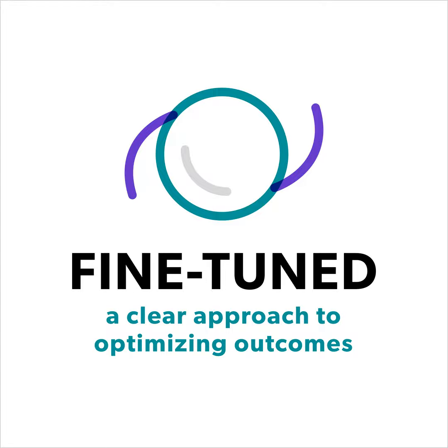What do you find is the advantage of wavefront-guided versus wavefront-optimized and topography-guided? There are a number of advantages of wavefront-guided over wavefront-optimized and topography-guided LASIK. As noted in our recently published study, wavefront-guided has better outcomes in a number of categories compared to wavefront-optimized. One big advantage of wavefront-guided over both wavefront-optimized and topography-guided ablations is that the refractive error is objectively measured by the aberrometer and is not based on subjective manifest refraction. We use the subjective refraction to verify the wavefront-guided aberrometry generated sphere and cylinder, but base our treatments on the objective measurements. This allows for very precise measurements of refractive error. For me, the major advantage of wavefront-guided over topography-guided ablations is the ease of use.